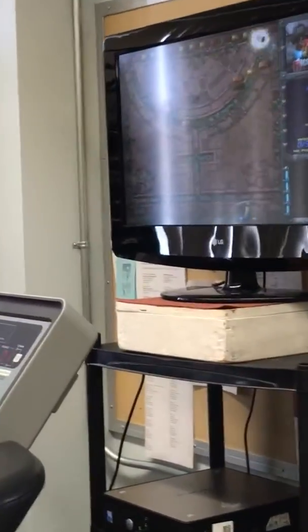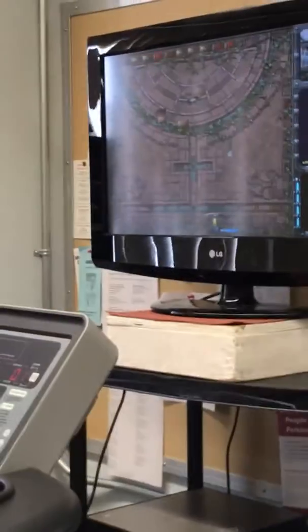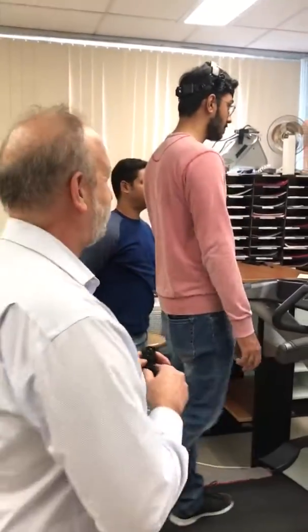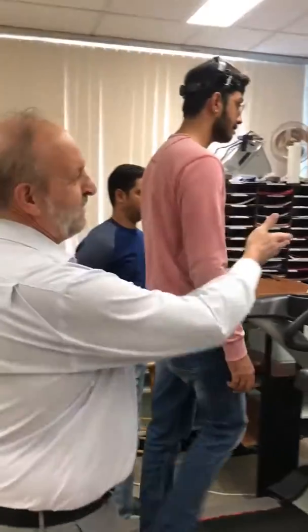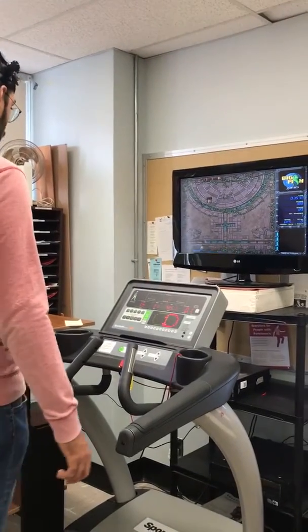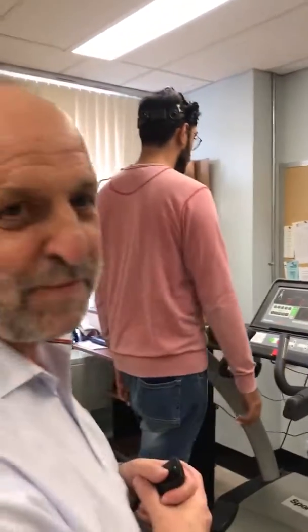So now we use it for treatment. We want to lead with a treatment program. But if you're going to treat somebody, why not embed the assessment into the treatment? Very cool. Dr. Tony Styurm at the Health Sciences Center in Winnipeg, University of Manitoba. And now we're playing our treatment games, which are standard computer games. Very cool.